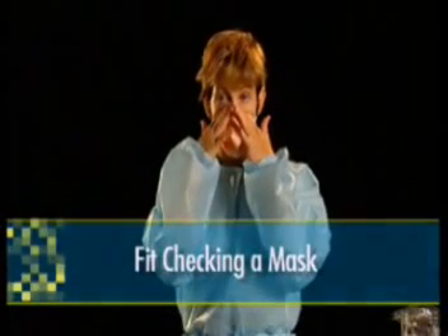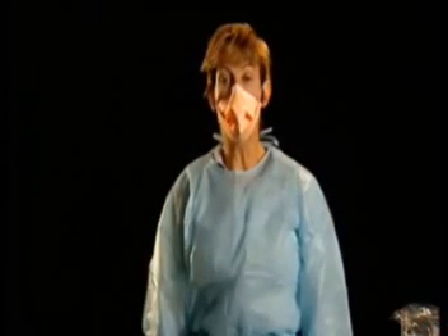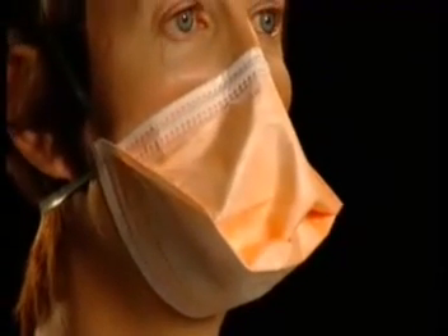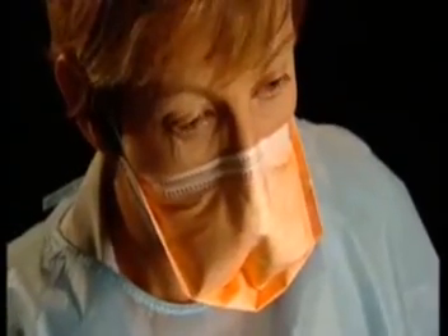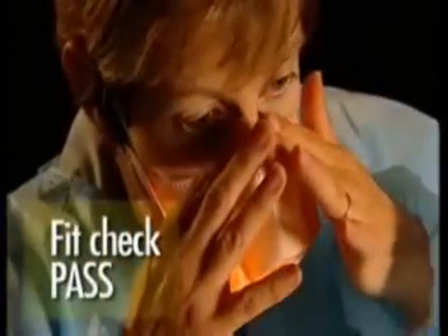Every time you put a mask on, you must perform a fit check. This is your way of ensuring your mask is correctly sealed around your face. If the mask is not correctly fitted, there is a potential for exposure to infectious airborne particles. To perform a fit check, take a deep breath in and breathe out. If the mask collapses when you inhale and puffs out when you exhale, and you don't feel any large leaks of air around the edges, your mask has passed the fit check.